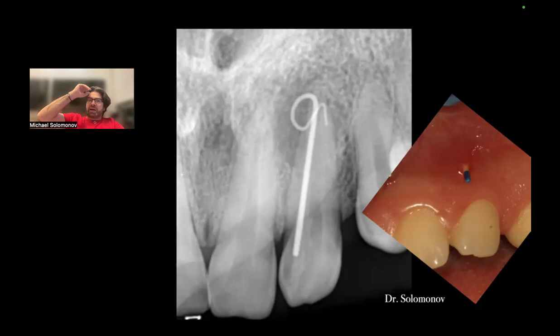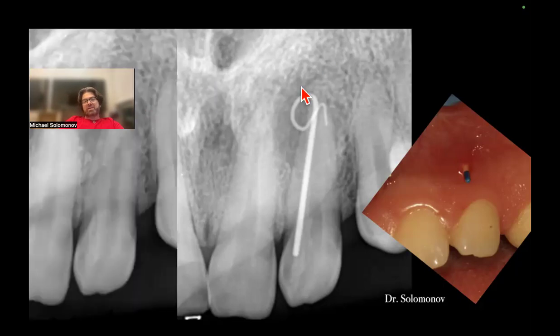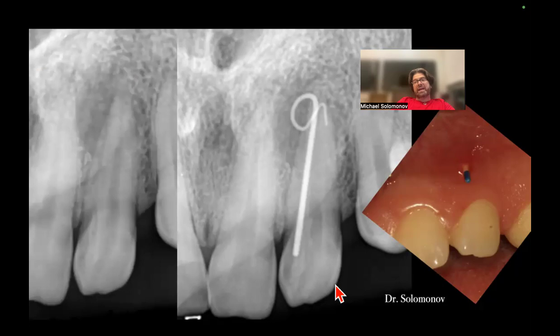I think sometimes dentists during the tracing X-ray can mask some structure inside of the tooth, and I think that we need two X-rays as a diagnostic X-ray, one with the tracing and a second without the tracing. And when I did a second X-ray without the tracing, I understood what I have here.